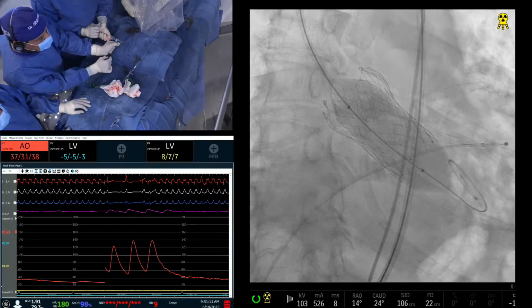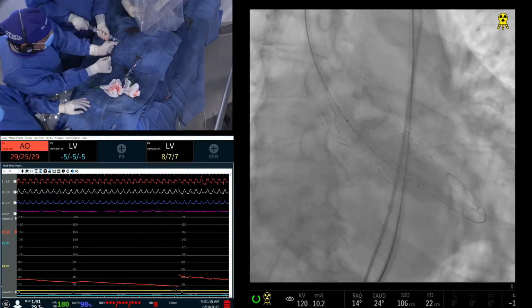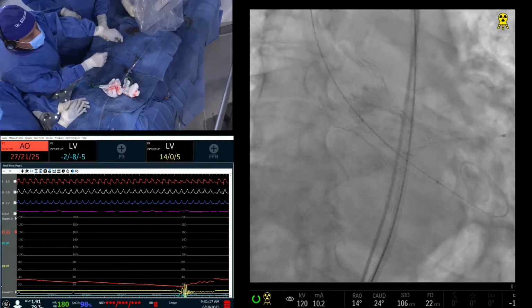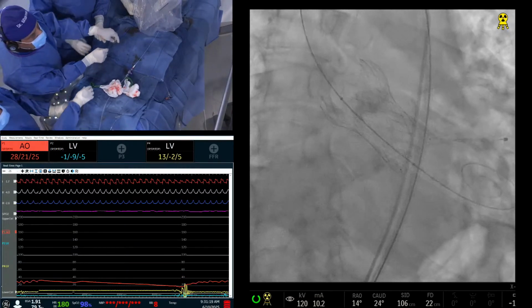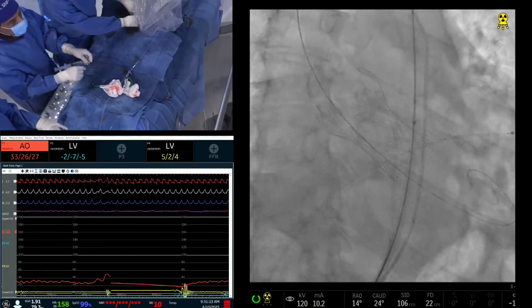So look at the clear difference. Expansion, yeah. Then you can see, okay, now the diamond, you can see the diamond. Okay, good. Okay, keep pacing, keep pacing. Okay, back up. Good. Pigtail. Get a picture. Back out, back out.